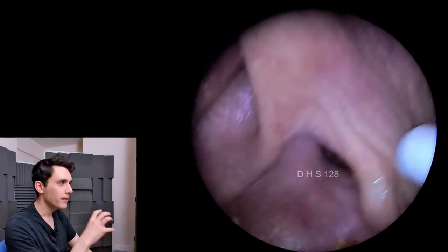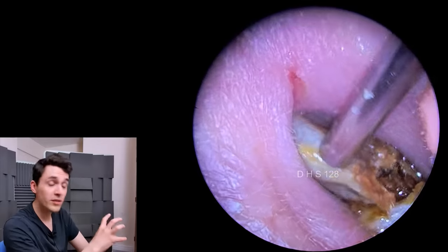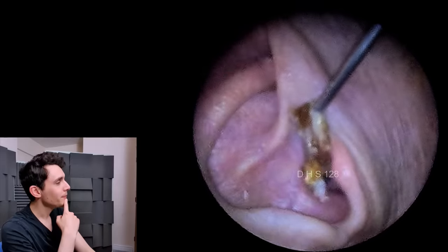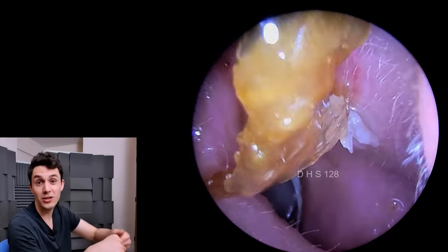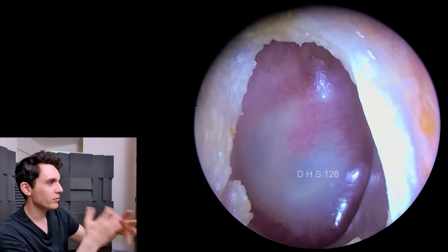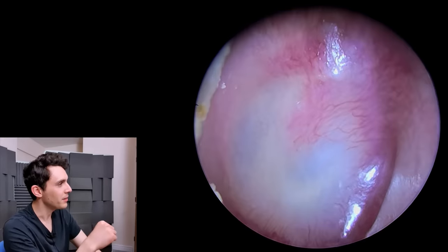I'm just applying olive oil here. This is the problem with a lot of tools on the market — there are a lot of curettes and scoops and hooks and things like that, and the vast majority of them are inappropriately large. That's what happens: you end up pushing stuff back in. There's the plug — it's about two and a half centimetres, though probably slightly longer than it really is because I've been stretching the skin as I've been pulling it out. The eardrum looks slightly abnormal — it looks thickened and rather featureless, but this is a very elderly patient. It looks a little vascular but it doesn't look infected, so overall that was a fairly successful case.